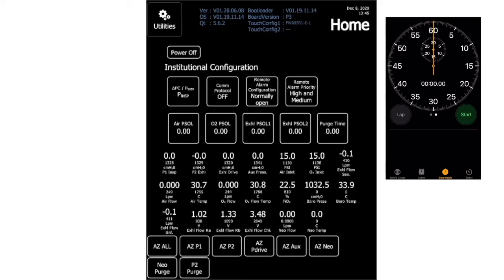So I first select my air PSOL, and you won't see the airflow change until I confirm the setting. As before, it's approximately around 0.75 or maybe just a little lower depending on the ventilator. And I do this to create an airflow of 3 liters per minute. Now I see the measured airflow is 3 liters per minute. And now I can use the plug or my thumb to occlude the inspiratory side.